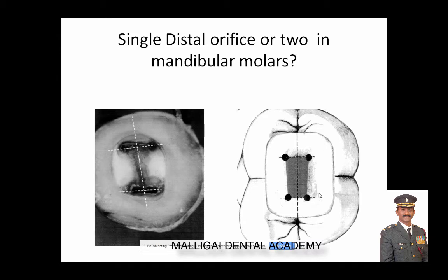And of course, the DG16 probe, one small addition to your armamentarium to locate canal orifices without difficulty and with ease.